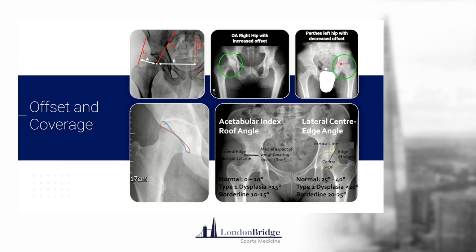An opposite is a shortened hip, right? So this one's got Perthes. You can see the neck is shorter, and therefore your lever arm for the abductors and adductors and all the rest of the hip and groin muscles is shortened. So that doesn't produce the most biomechanically advantageous hip from that point of view. So you might lose function and strength from that point of view. So two ends of the spectrum there.